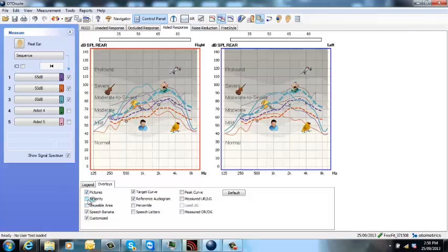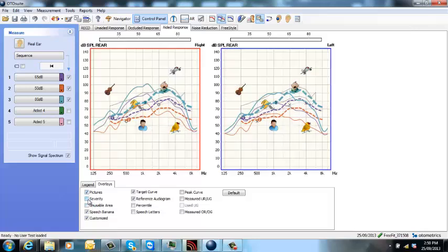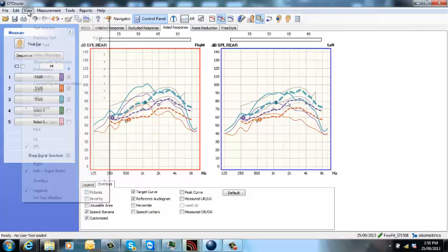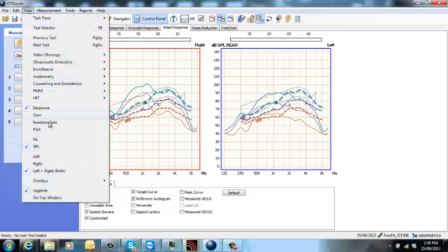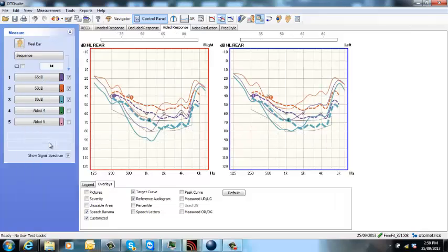Again, you can change to HL or you can keep it in SPL, whichever is easier.